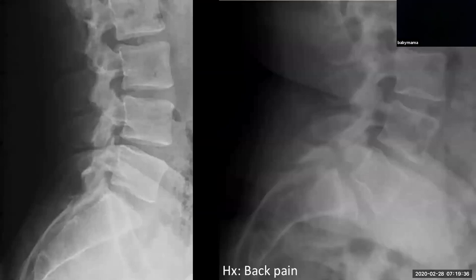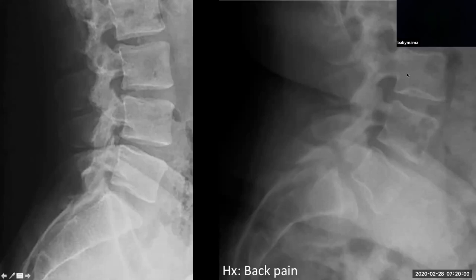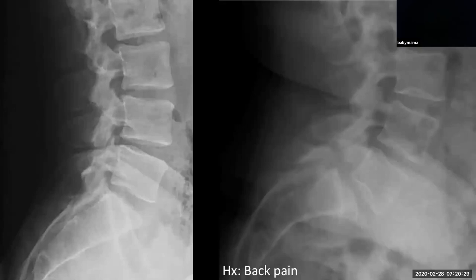Diving into the cases — I've tried to show normal anatomy on the left and pathology on the right. Starting with this case: the history was back pain. Looking at the A in our ABCs — alignment — tracing the posterior vertebral body line all the way down, you have a step-off between L5 and S1. And you'll notice a lucency at the inter-articularis region of the PARS — that is the PARS defect. This is a case of PARS defect causing spondylolisthesis of L5 on S1.